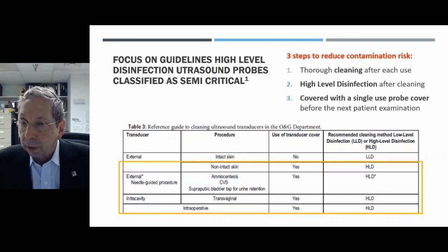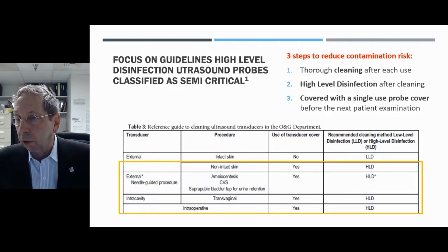And as you can see, in the guide to ultrasound cleaning, use of transducer covers is recommended when you're touching non-intact skin, for amniocentesis or suprapubic bladder taps, and transvaginal probes as well. And high-level disinfection is recommended for all but use of an external probe on intact skin.